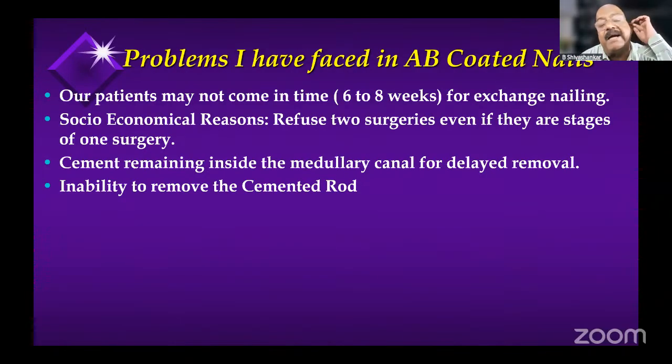Cement retaining inside, debonding of the cement and difficulty to remove. As you have heard in the earlier talk, almost 21% of the cases, cement gets retained. So that is another problem. Inability to remove cemented rods. Sometimes the patient comes so late that it is really difficult. It has already got bonded with the bone and it is really difficult to take that out.